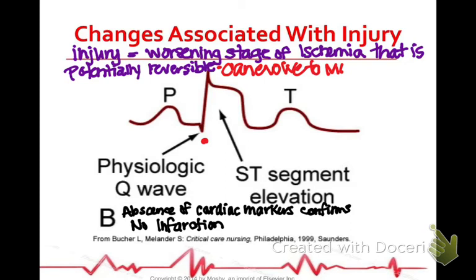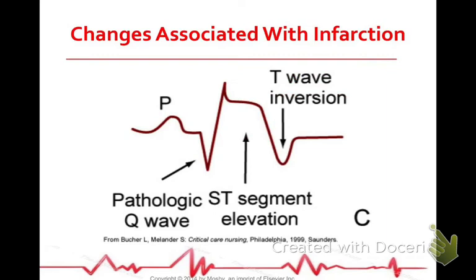All right. This is an infarction. See how your Q wave even went further lower? You've got the same ST elevation, then your T wave inverts. This is showing this is damage happening. Infarction. You're going to have positive markers with this.